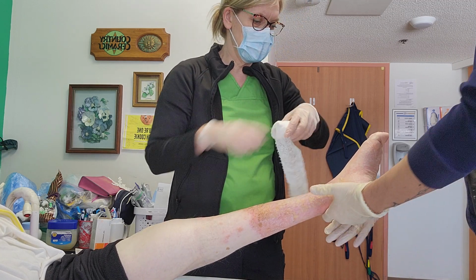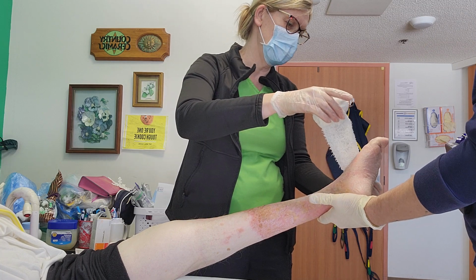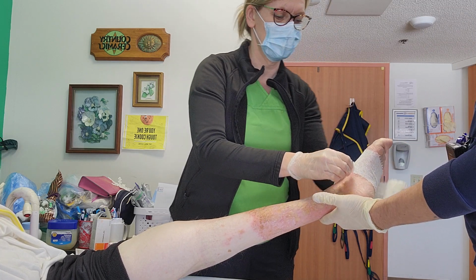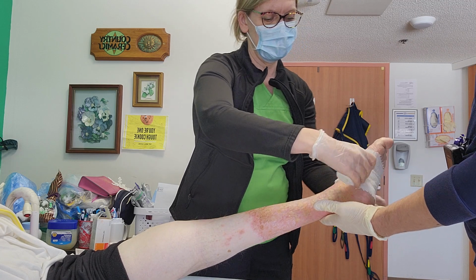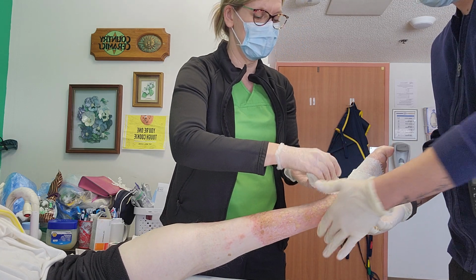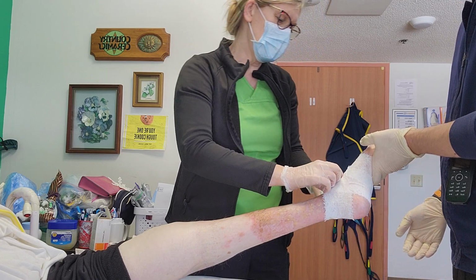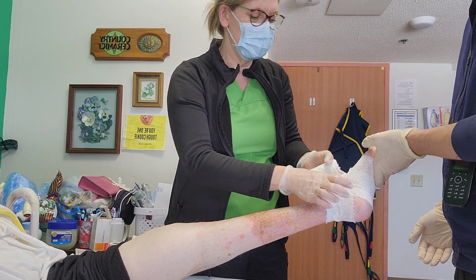We unravel the Viscopaste right onto her foot. And I start the C pattern, believe it or not, right on the foot. I know the instructions show that you don't have to, but I do. That way I get a good even coat of the Viscopaste all the way around. Now, what I'm actually doing today is a modified Una boot.